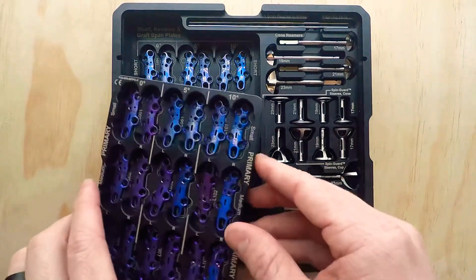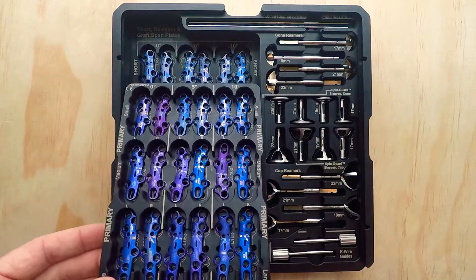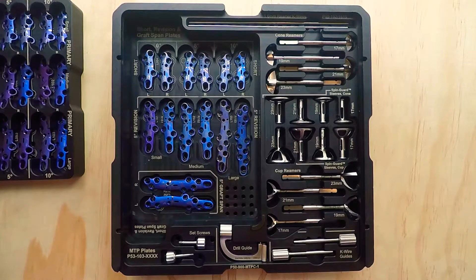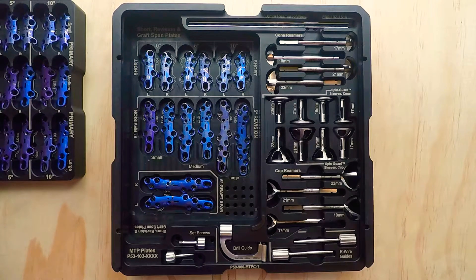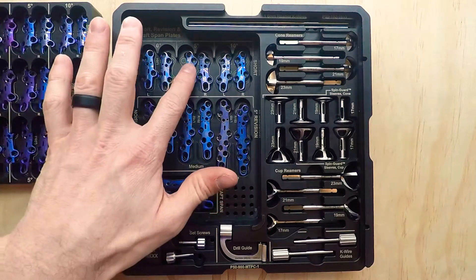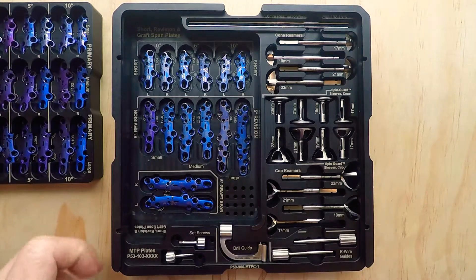These primary plates are 1.3 millimeters thick — a very low profile plate. When you put the screws in these plates, they do not get thicker. That's very important, because I've worked with companies in the past where plates are marketed as low profile, but the second you put a non-locking screw in, it goes from 1.3 millimeters thick to 1.8 millimeters thick because of head prominence. All of our screws sit inside the plate — zero head prominence.